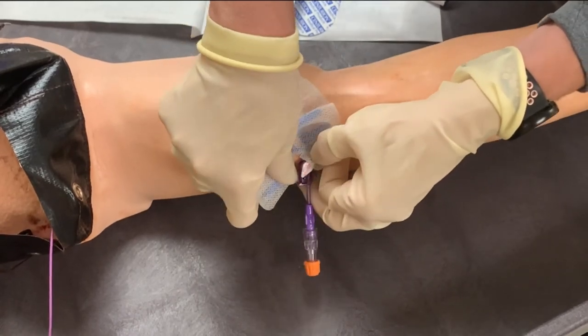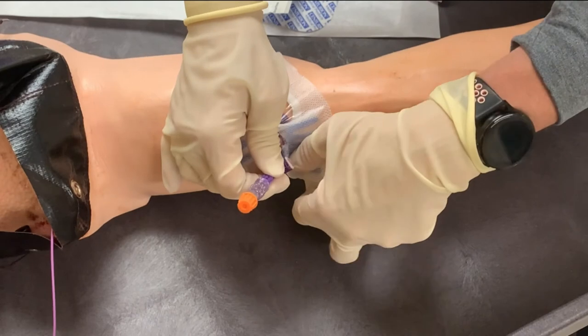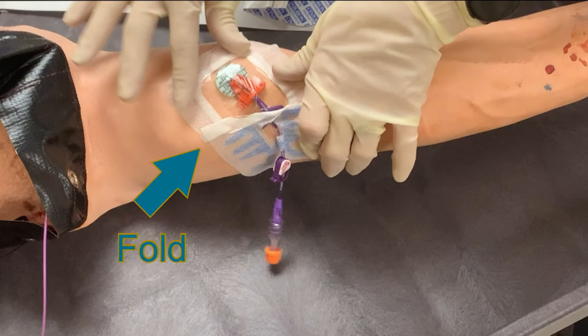The slit at the bottom of the shirt needs to be above the pinch clamp. You will need access to the clamp, so make sure it is not covered by the dressing. If the winged hub of the catheter couldn't fit in the window, ensure it is at least covered by the shirt. The securement device aspect of this dressing is only truly effective if the hub is contained under the dressing. The dressing may have to fold in on itself in order to keep the pinch clamp accessible, and that's okay. Just ensure that the dressing still creates a continuous seal on the patient's skin, so there is no path for infectious agents to get under the dressing.